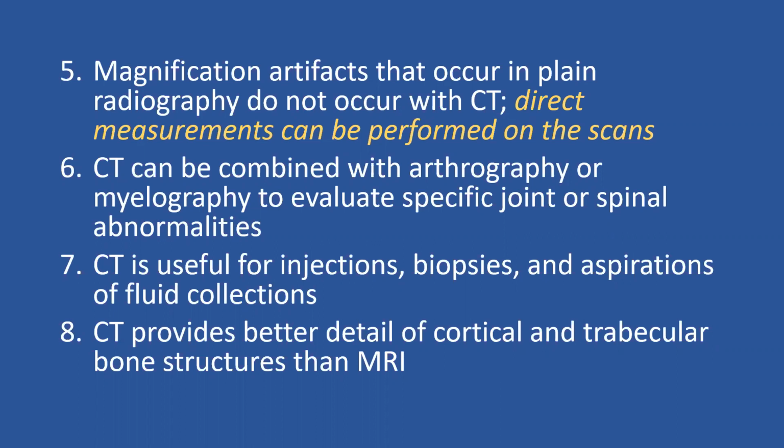The intervention radiologist lives on CT. He takes his biopsies. He uses core biopsies. He directs the needle to the area where he needs most, and he aspirates and sends to pathology. You can also aspirate fluid areas. These are identified by CT scans. And CT provides better detail.